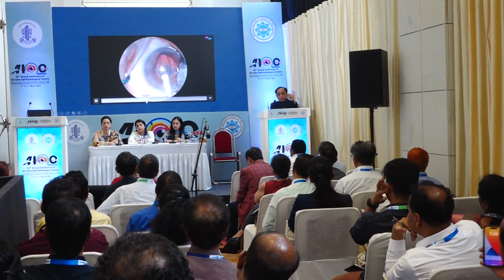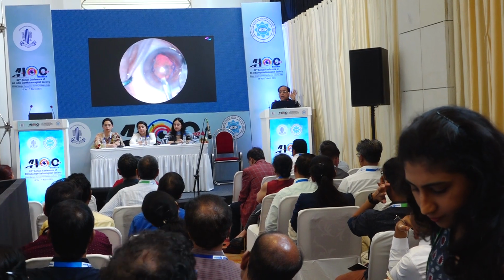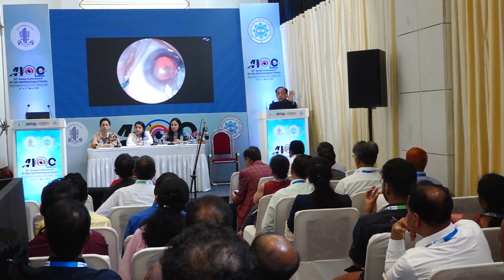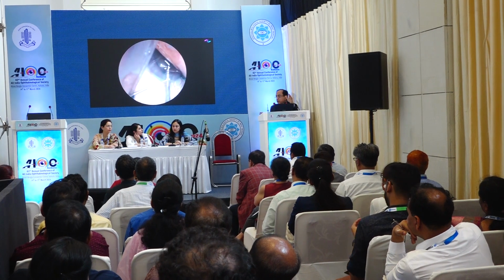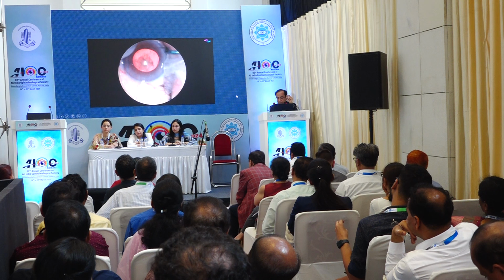So in this case, the iris was small and floppy. Instead of struggling and keeping on lowering the parameters while the iris gets sucked, it's better to use the dilating device and do the surgery comfortably. Particularly if the cataract is hard, the pupil is borderline, and you feel uncomfortable, it is better to enlarge the pupil and then go ahead with your normal parameters.